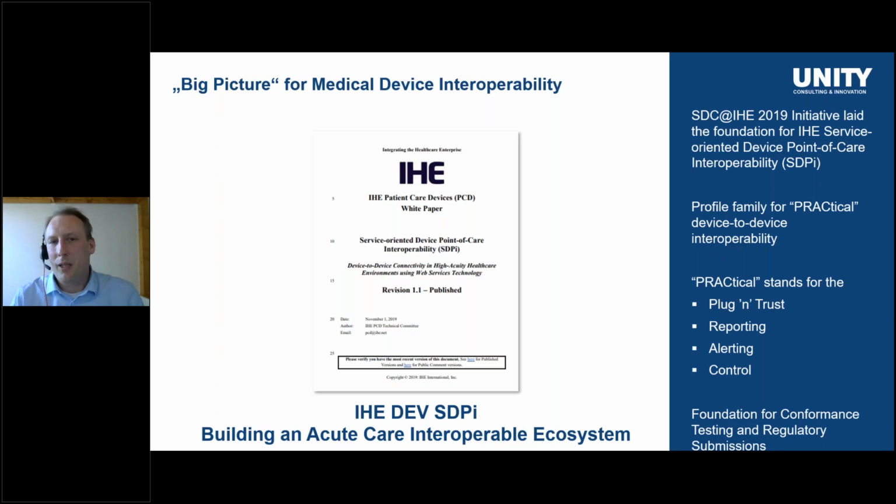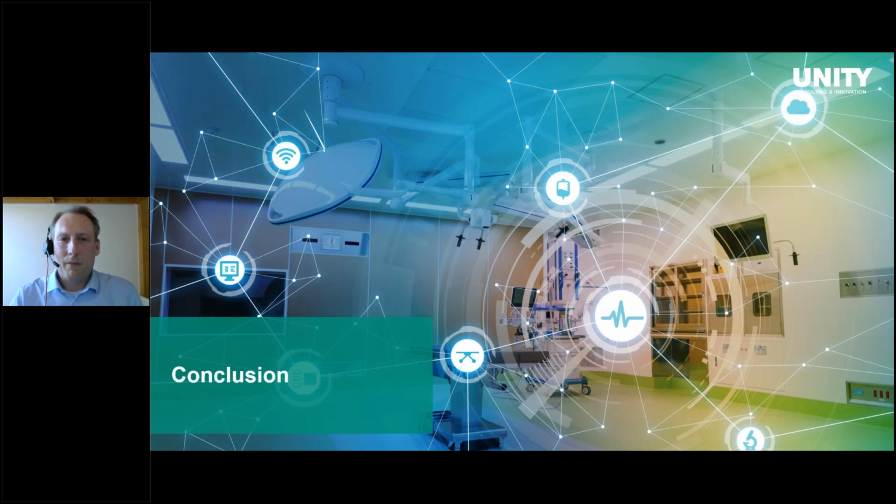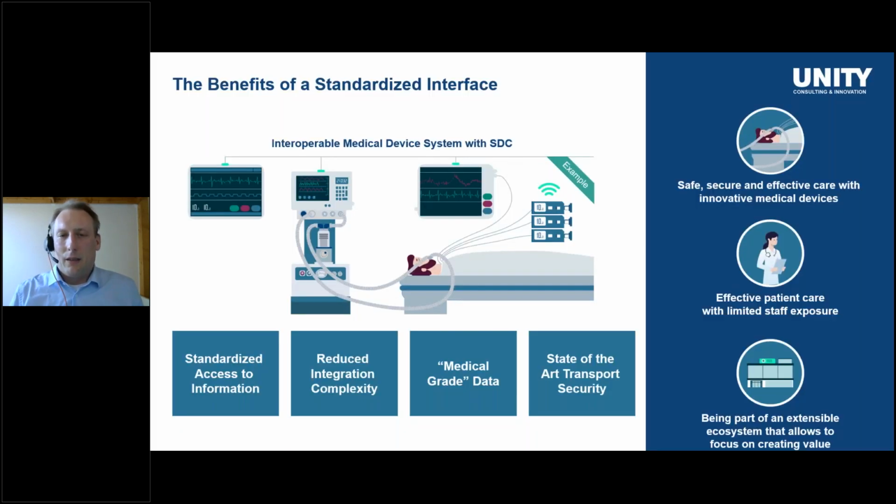I would like now to come to my conclusion so that we have enough time for our discussion. This will basically summarize the benefits of a standardized interface as I see it, especially with a focus on the use case of our device A that I used through the whole webinar. One big aspect here is, of course, that from device A's perspective, it has standardized access to the information, which definitely reduces the integration complexity for devices like device A, all these kinds of clinical applications.